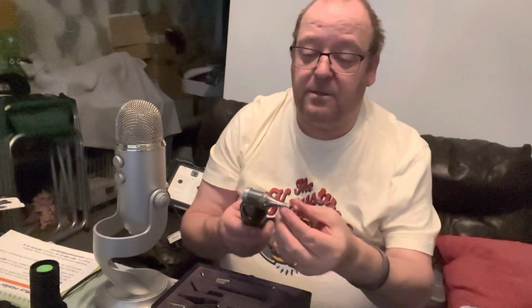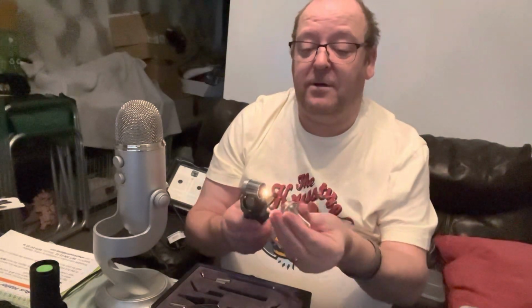Now I've also got the otoscope. So now I would put a cap on there, or I could just sterilize that and I would look inside somebody's ear. So you've got a nice bright light and you can see that that's shining onto my hand. That would be placed in the ear, and then the audiologist would be looking down to see.